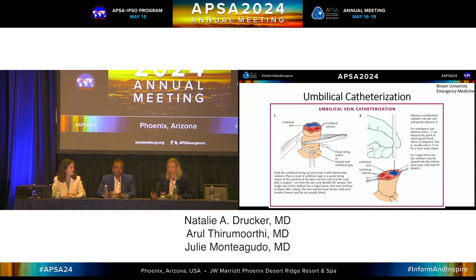And sometimes, you know, people can freeze in this situation, and we, as pediatric surgeons, often have to remember all the different options and not just the things that we're most comfortable with. You tie down the umbilical tape to prevent back bleeding from the arteries. If that doesn't work, you can always ligate those individually.